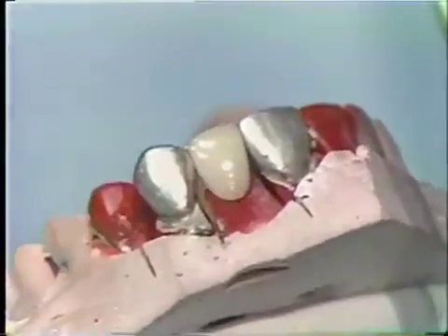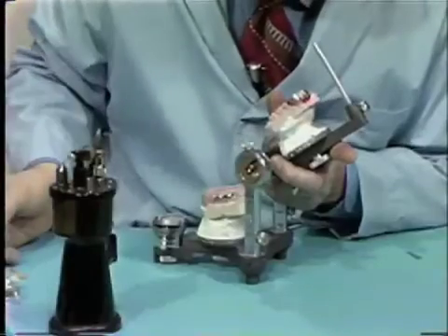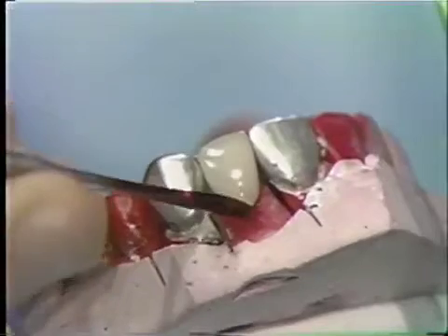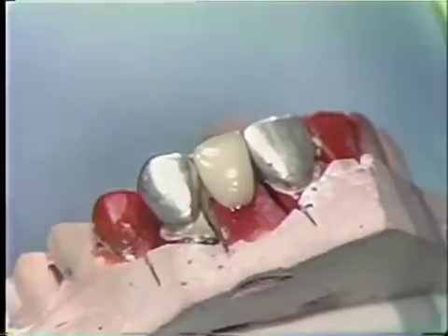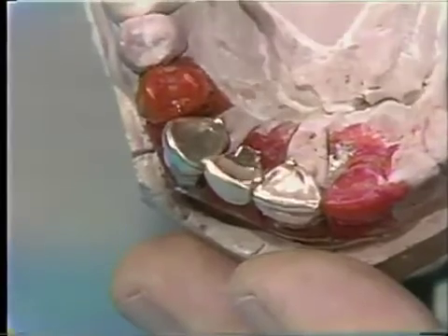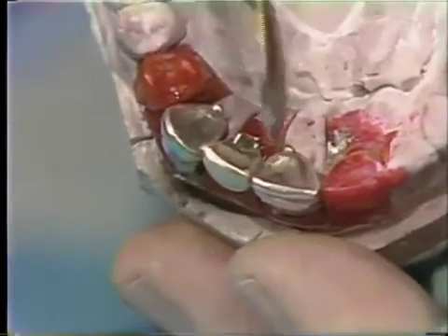Before the soldering relations are taken, the pontic is secured to the model with sticky wax to make sure the facing has a proper relationship with the ridge. When this is done, the relationship is examined from the lingual surface.